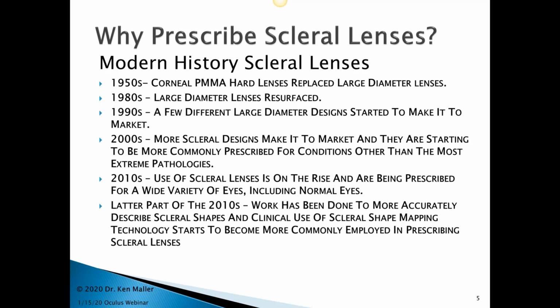And then in the 2000s, they really started to become fairly commonly prescribed, not only for some of the extreme pathological conditions, but maybe even for high ametropia and some of the dry eye scenarios. So they were starting to make their way into a little bit more general use. By the 2010s, they were definitely on the rise.